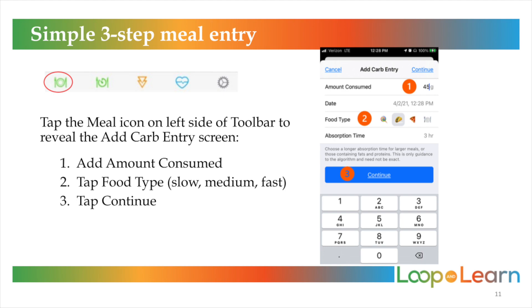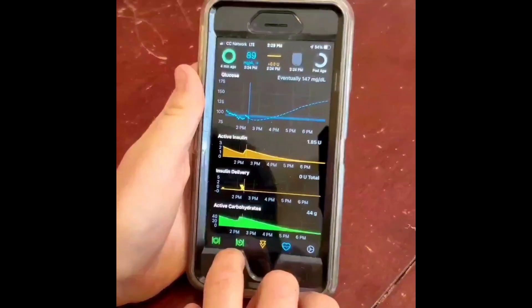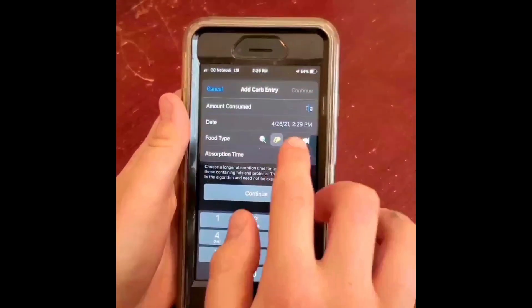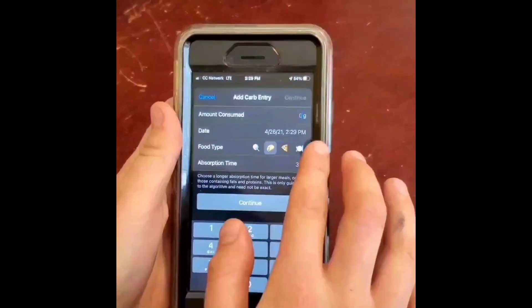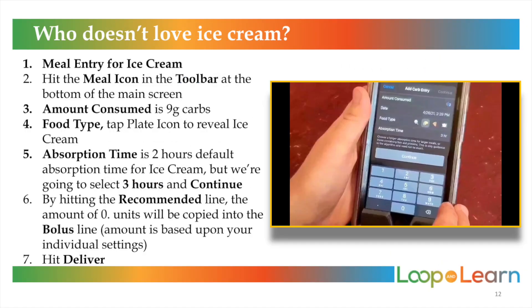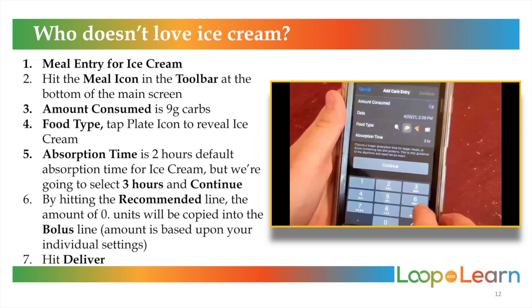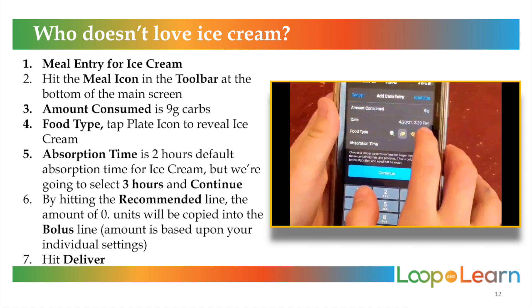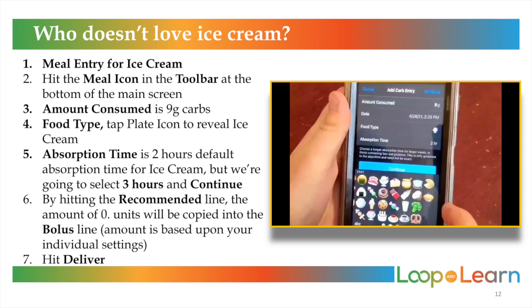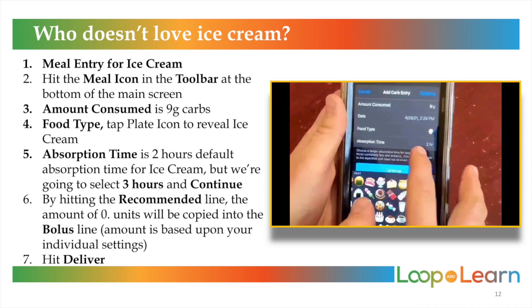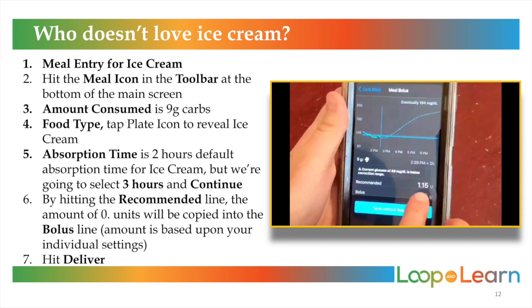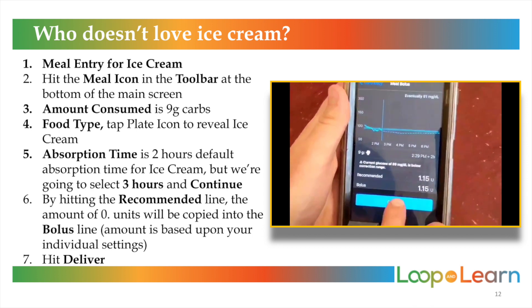Let's do a simple three-step meal entry. First, tap the meal icon on the left side of the toolbar to reveal the Add Carb Entry screen. Add the amount consumed, tap the food type, and tap Continue. Who doesn't love ice cream? Let's put in 9 grams. Tap the food type right there to reveal ice cream — it'll be a two-hour absorption time. Then hit Continue, and deliver.